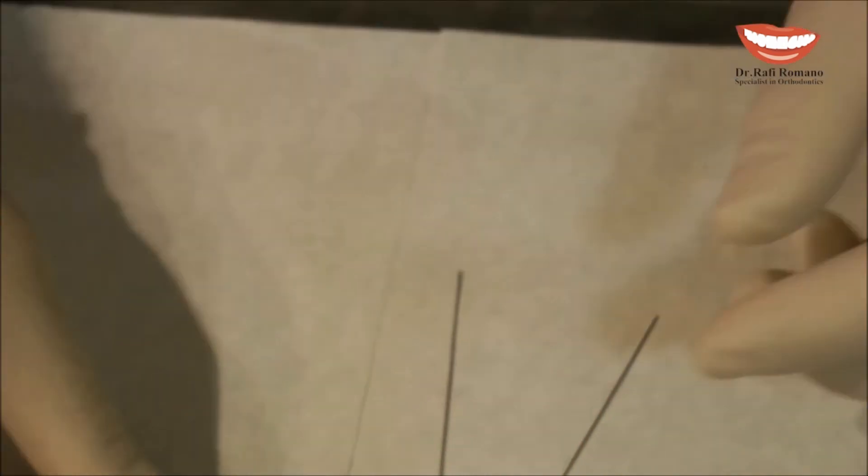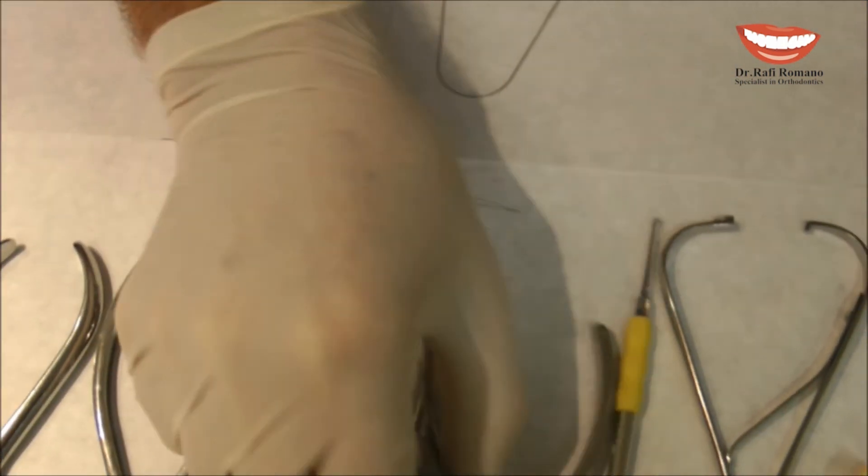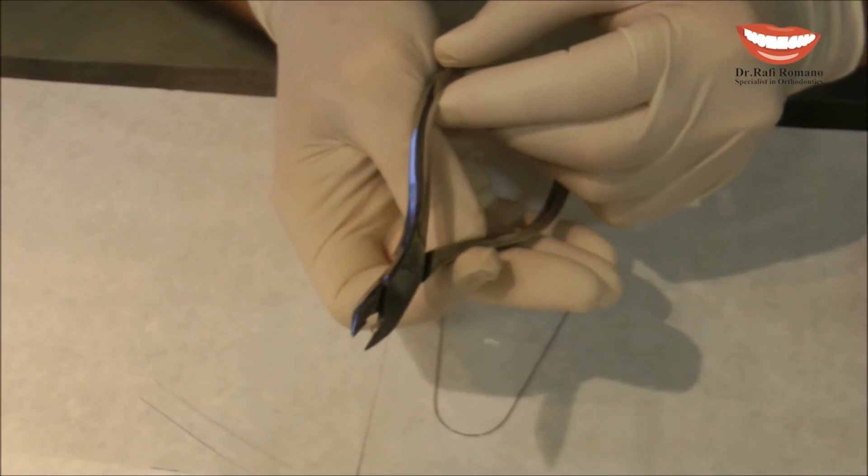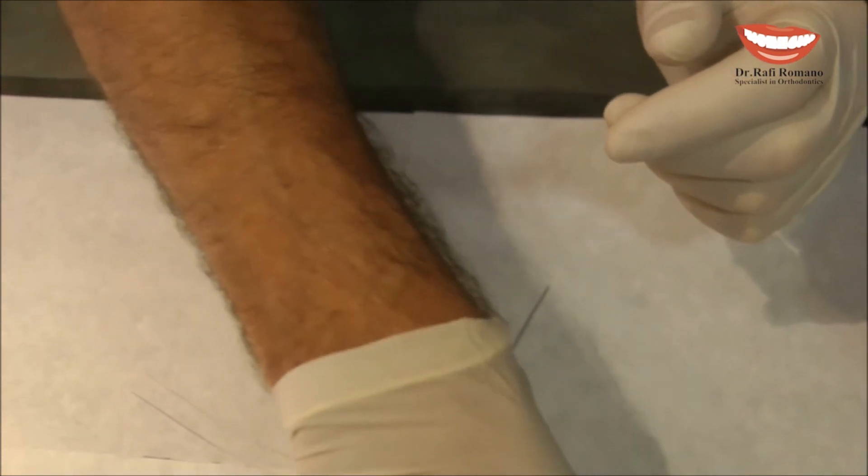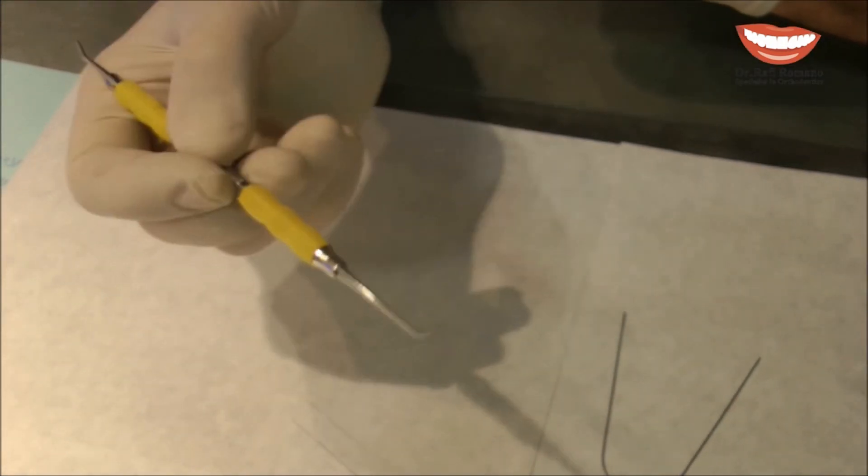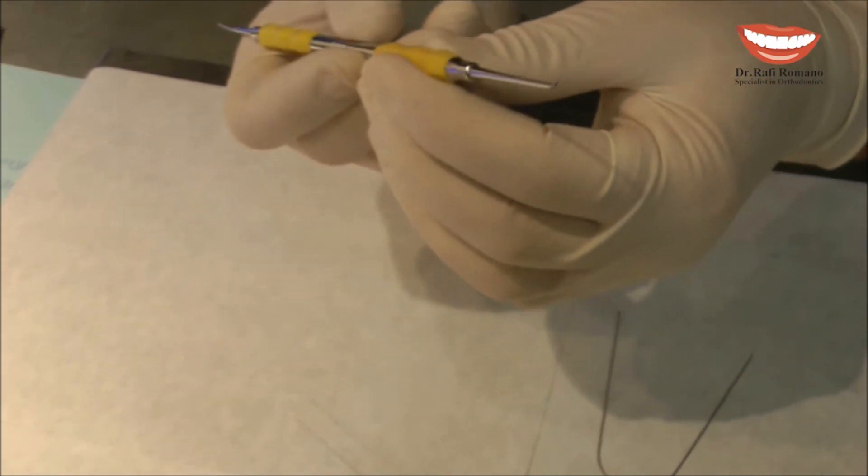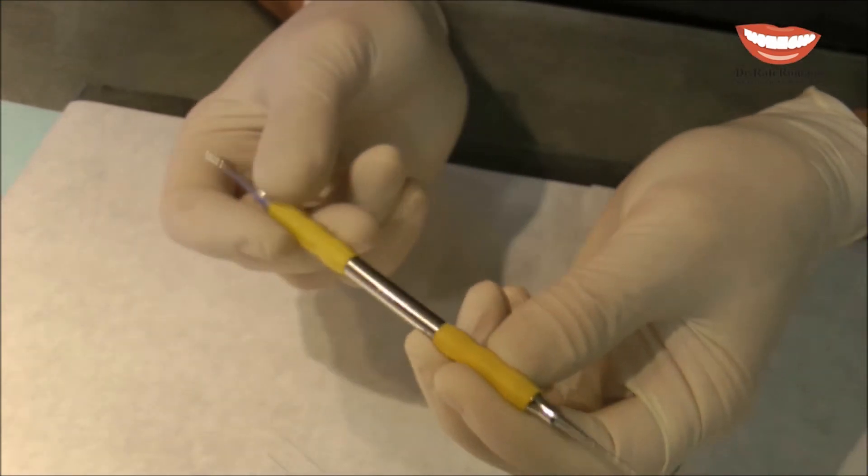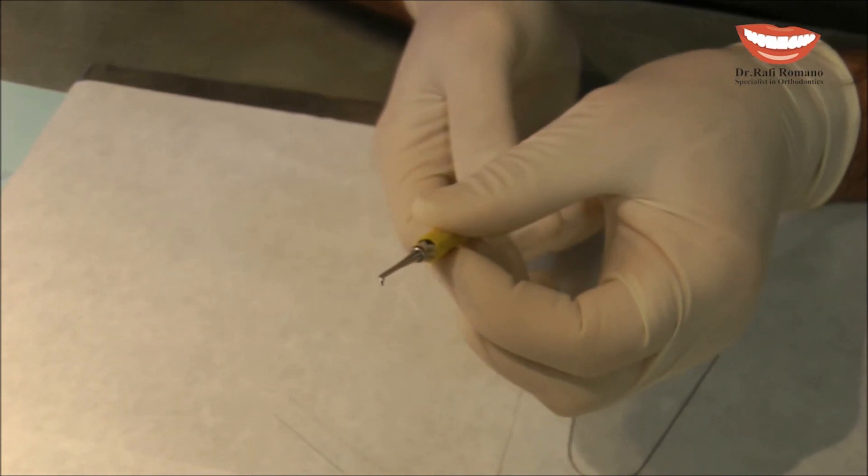I'm using to cut the metal ligature a normal cutter and I have here also a lingual ligature director. You can see it is angulated 45 degrees. Very useful.